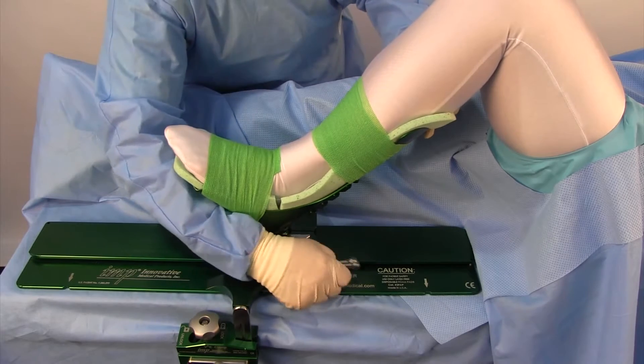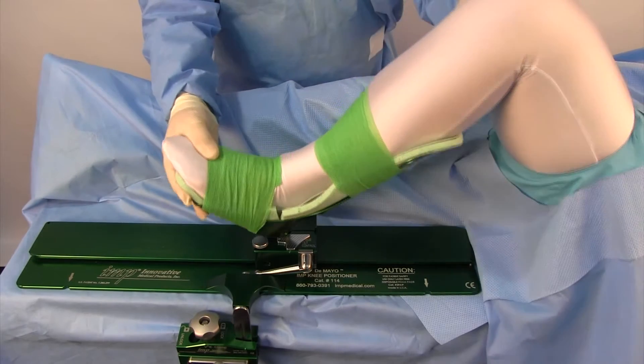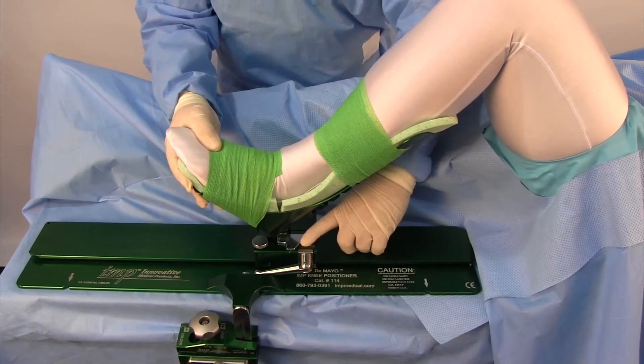This is a demonstration on the Varus Tilt Slide Lock. This feature will allow you to control the amount of Varus Tilt that is desired and also positively lock the boot to the carriage.